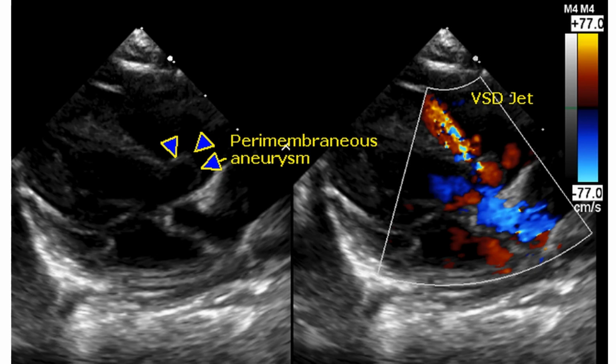The size of a ventricular septal defect, VSD, is compared to the diameter of the aortic annulus. If it is more than half of the aortic annulus, it is considered a large VSD. There is another classification into small, medium and large, depending on VSD size being less than 1/3, 1/3 to 2/3, and more than 2/3 of aortic size.